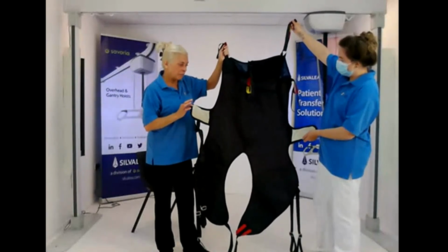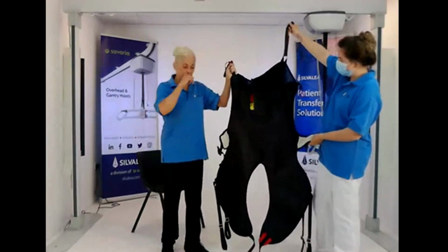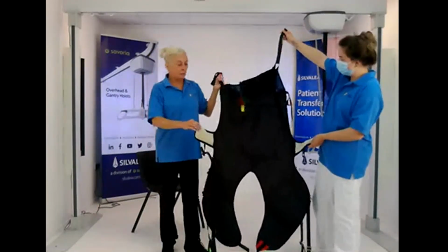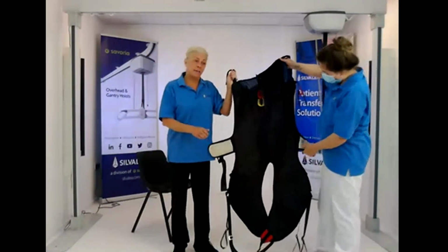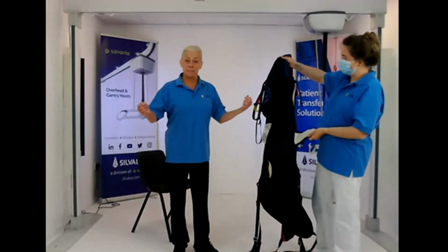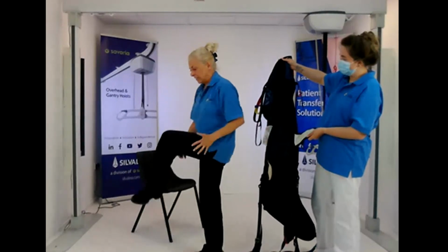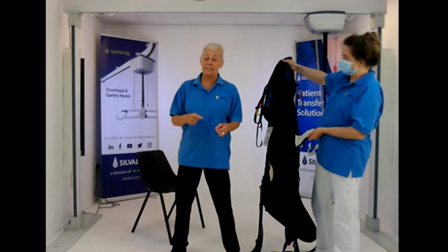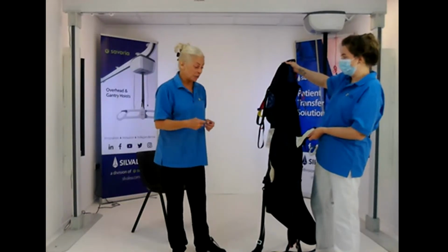So the original request for this was a wriggler, a bit like the scenario that one of our guests was talking about. Wriggles, twists, extends, escaped out of everything. So the idea was to find something that he could wear that would help to break up the extension by keeping him forward, his shoulders protracted, his hips flexed, just to keep him safe. I mean, the idea is to keep him safe for the transfer. And it worked really well in his situation, certainly.